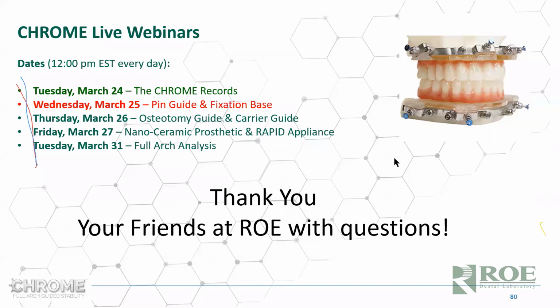I would use it at the highest part of the apex, the highest point of the CEJ, upper and lower. And again, just use it as a tool. I mean, a lot of times with these patients, you have inflammation as well, or you have severe super eruption of the lower teeth, and it can give you a false number. We've had great success with it though, and definitely use it clinically.